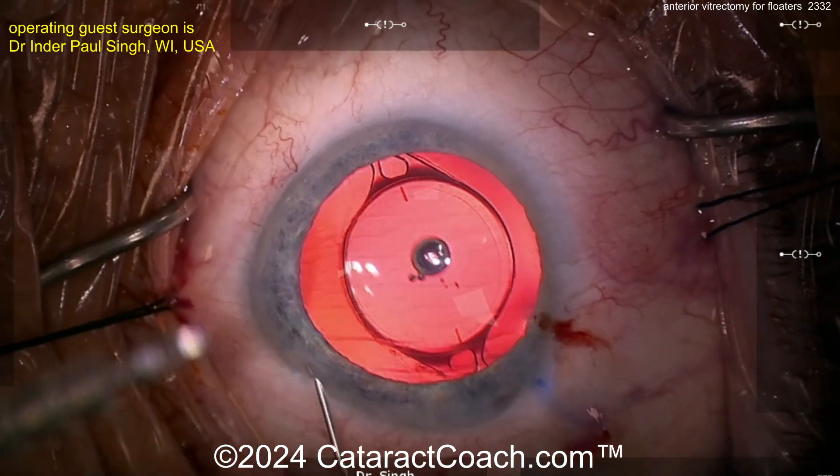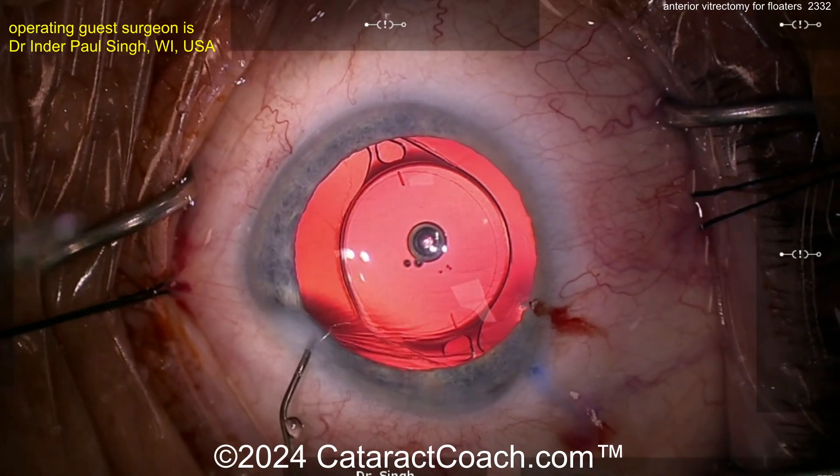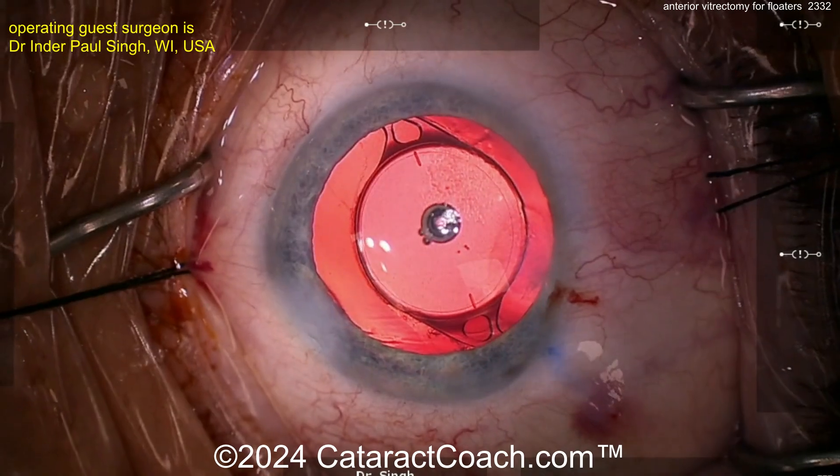Pretty straightforward, efficient surgery — minimally invasive. These patients are extremely happy right away and even the next day. Do check the retina right away immediately after surgery, post-op day one, one week, and one month. I hope this helped. Thank you so much for watching.